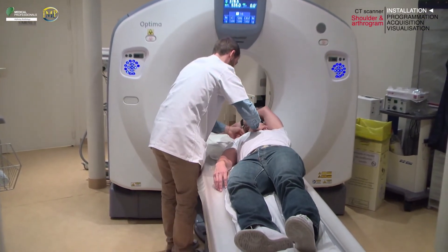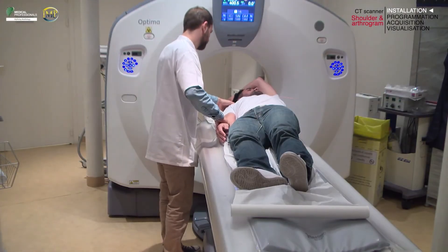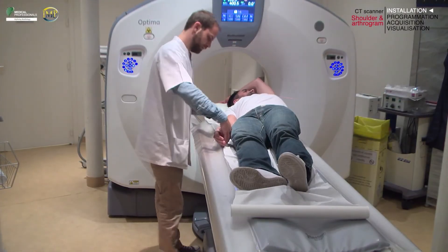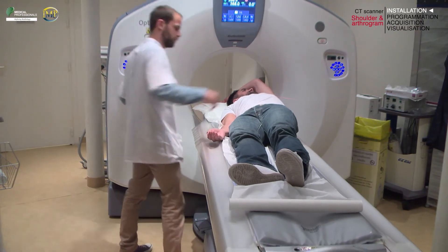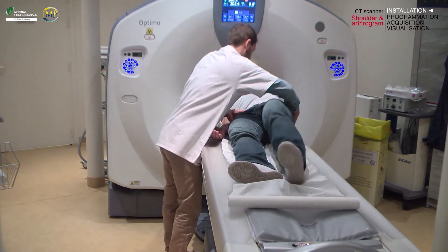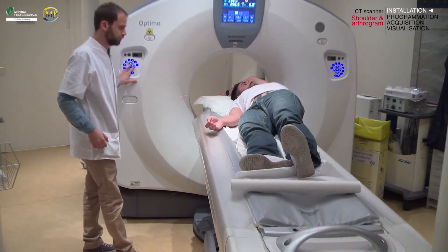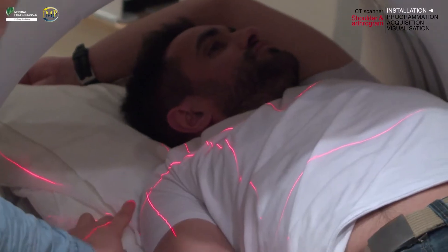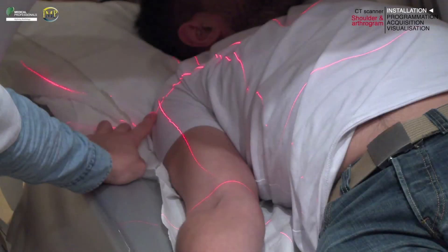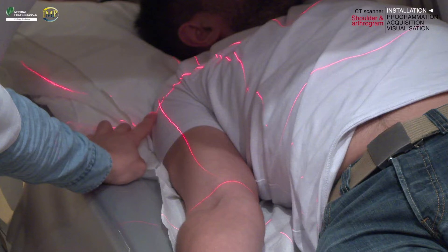For better image quality and dose reduction, it is advised to attempt to get the affected shoulder as close to isocenter as possible. Place your central ray on the humeral head with the internal axial laser light. Verify that the lateral laser light is at the mid-coronal plane of the shoulder.